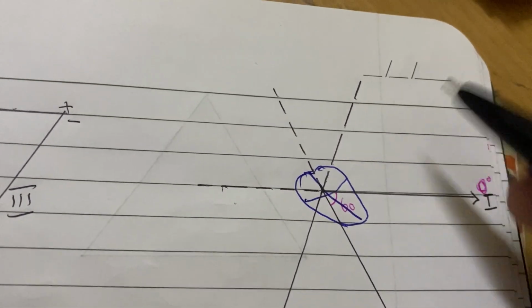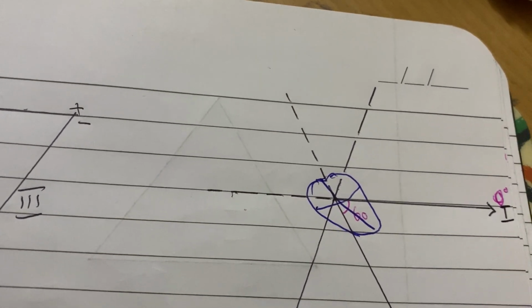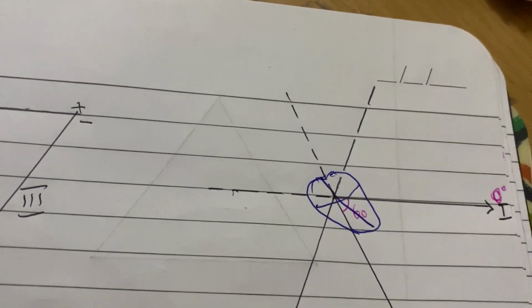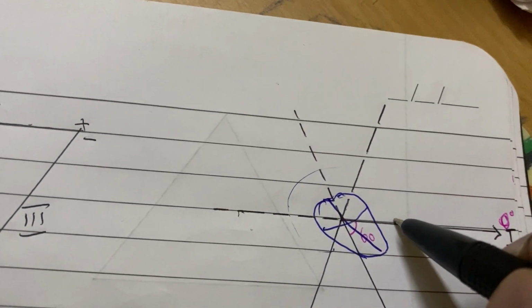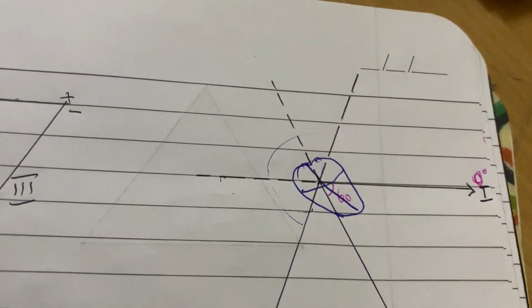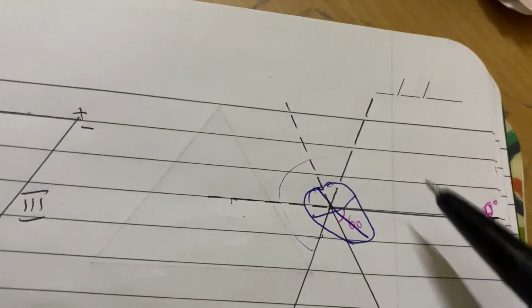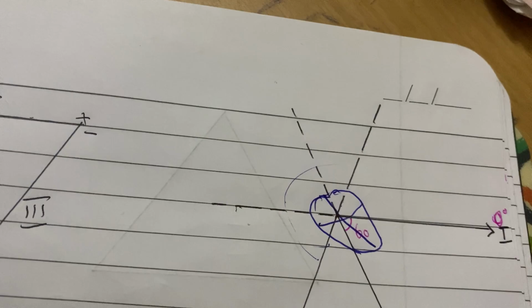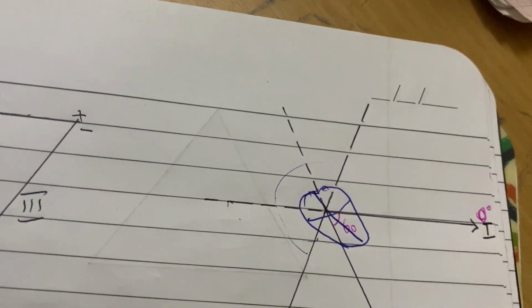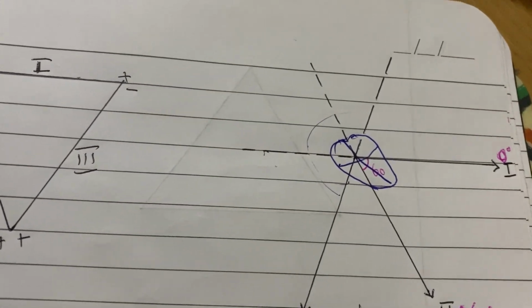Same applies here. With only 3 leads, we are only seeing the inferior part and one part of the lateral part. Whatever is happening from here going this side, we actually don't know. So that's why someone decided that we have to create more leads to see other parts of the heart, and those were augmented leads. Now we are going to put them here to complete the Hex-axial system.